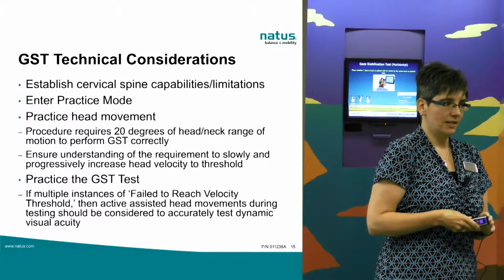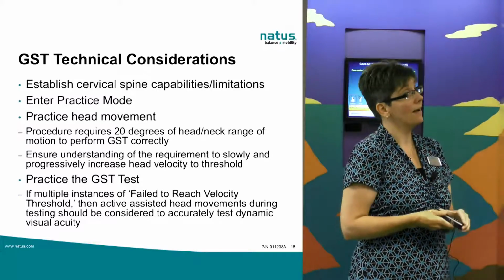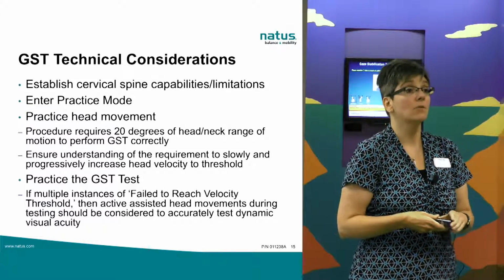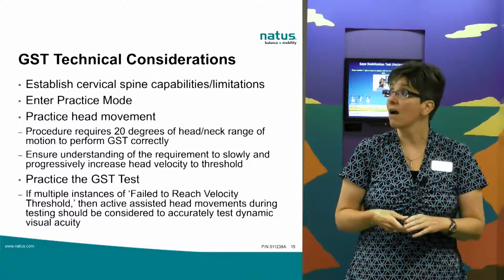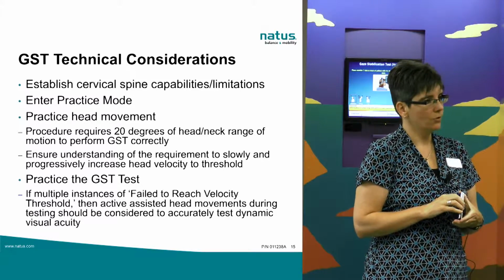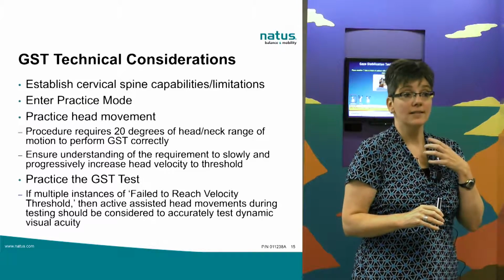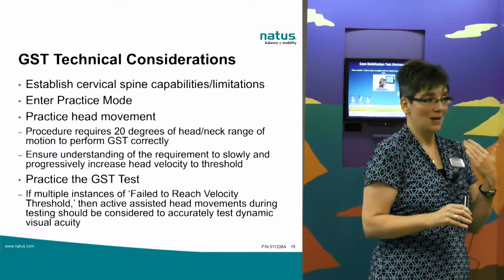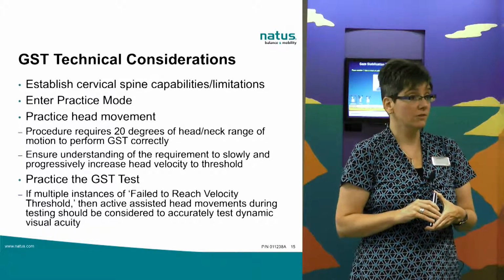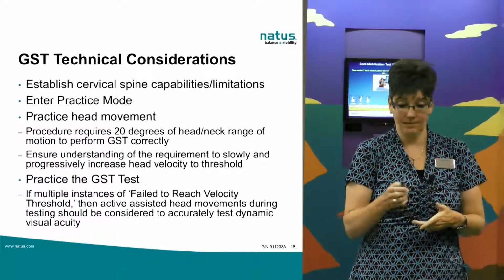Both the DVA and the GST require practice. I highly recommend that both you as the operator and your patients have practice trials because it will really smooth out the consistency of your data. Most of my patients are traumatic brain injury or concussion patients, and so the neck is always a consideration whenever you're asking the patient to do any testing with head movement. So it's really important that you're looking at the cervical spine in your exam before you do any of these tests.